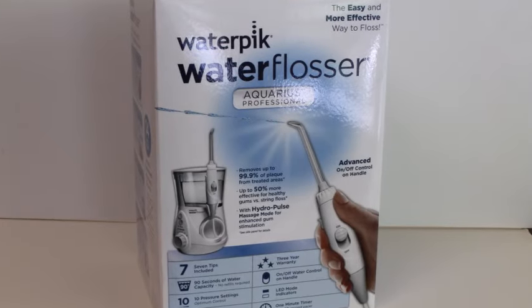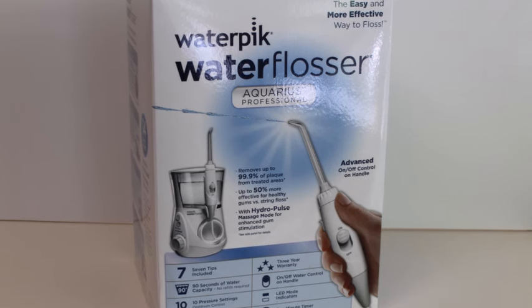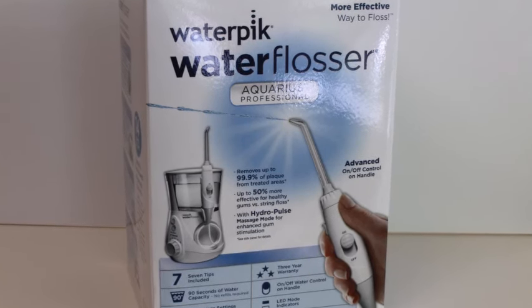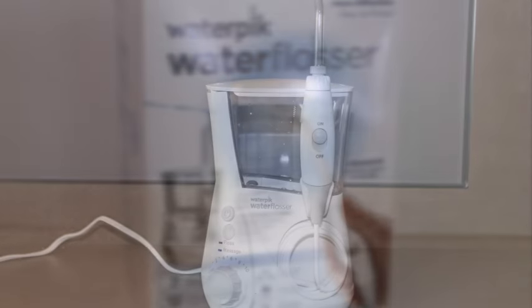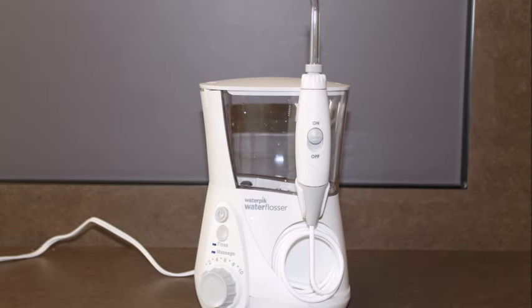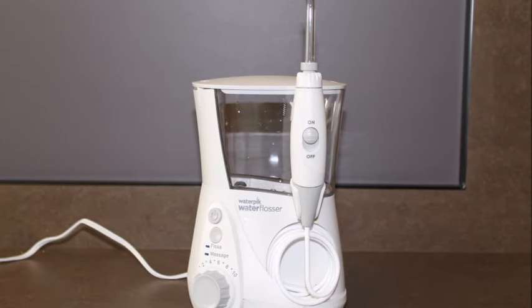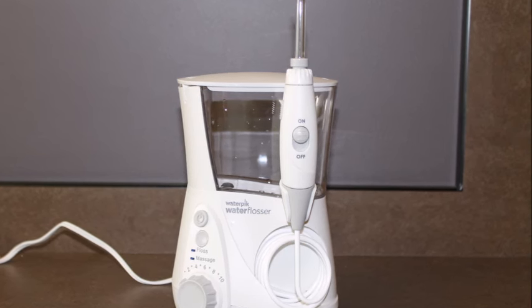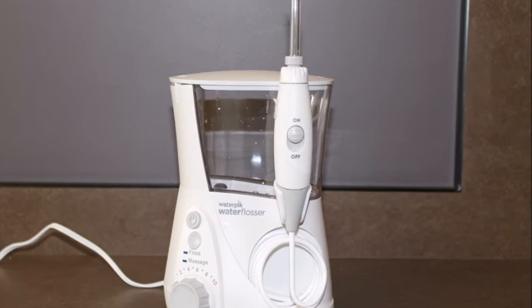Your dentist or dental hygienist has recommended that you use a water pick or similar device for irrigating the gums at home. This video is intended to teach you the correct technique so that you can get the most value and effectiveness out of using this for your oral care. This is an extremely valuable tool, but only when used correctly and with proper attention and focus.